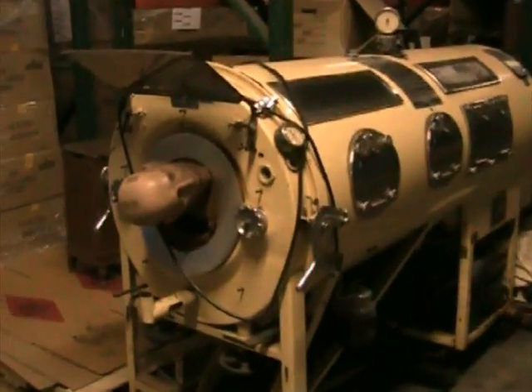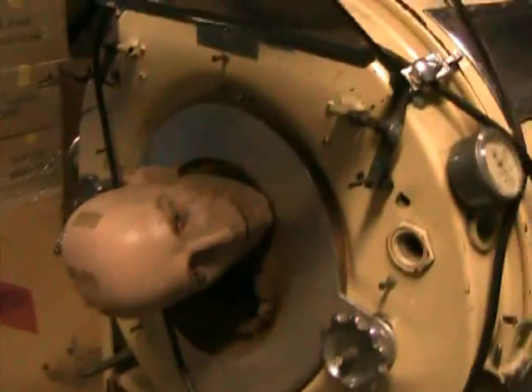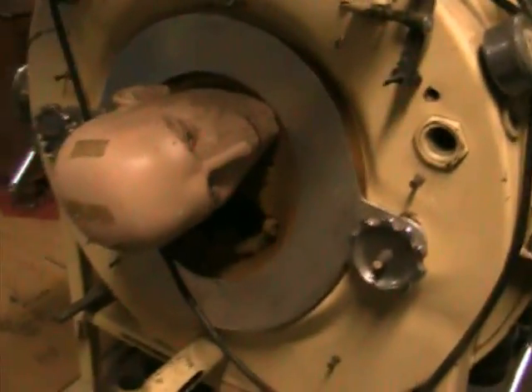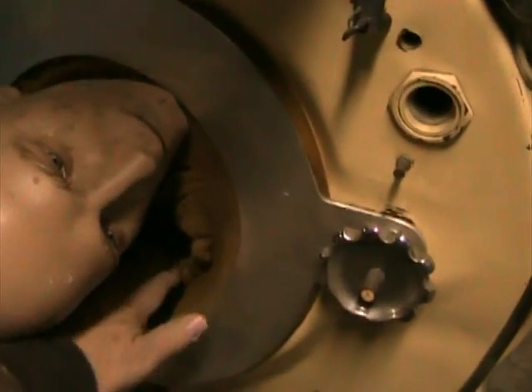The iron lung. Here we have the head and the collar — it's dried out and breaking down — but this would fit tightly around the patient's neck to create a seal.